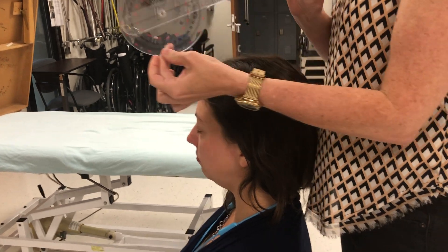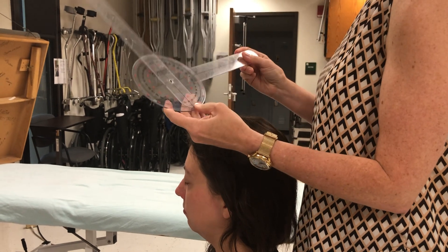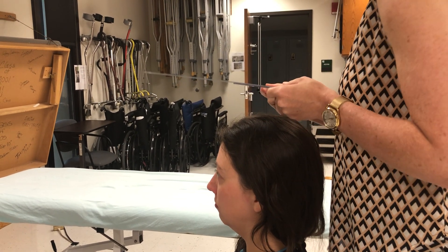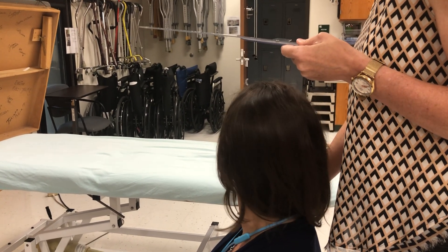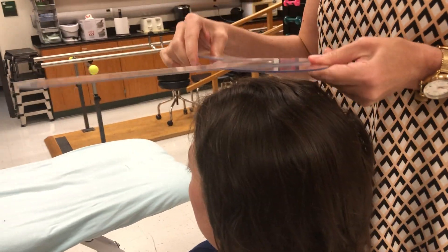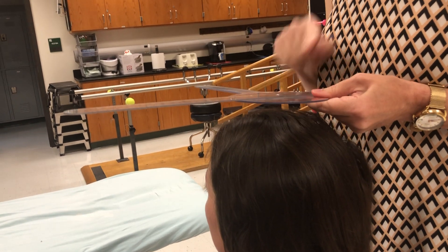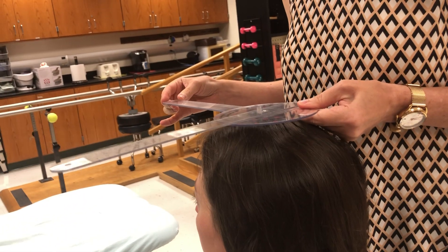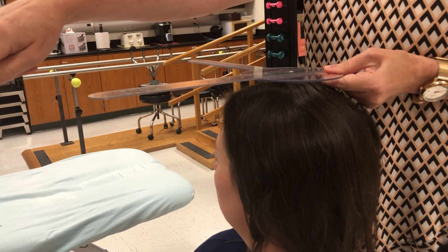I'm going to hold my goniometer — this is the starting position. It doesn't matter if your stationary arm is going over her right shoulder or her left shoulder, it doesn't matter. I'm going to give her the cues: turn and look over your right shoulder as far as you can go. After she's moved, I place my fulcrum over the center aspect of the cranial aspect of her head. I'm not pressing into her head, I'm giving a little space here. After my fulcrum is in place, I line up my stationary arm with the black line on the floor — luckily her acromial line was parallel with the black line on the floor.